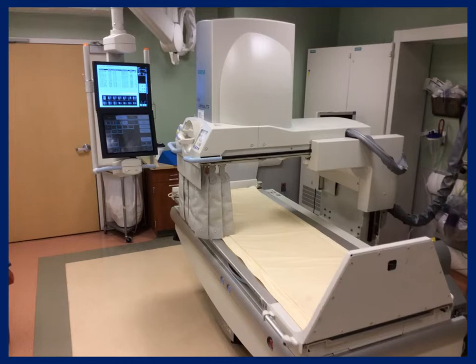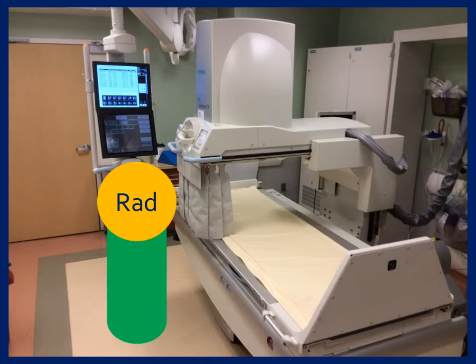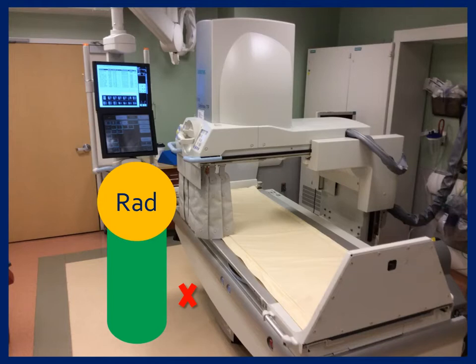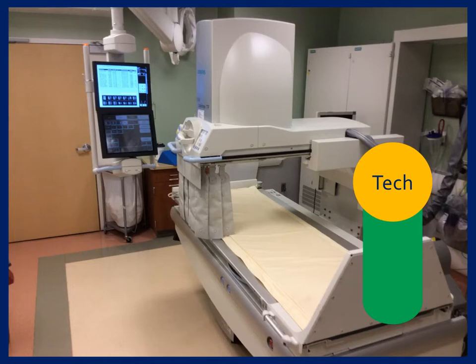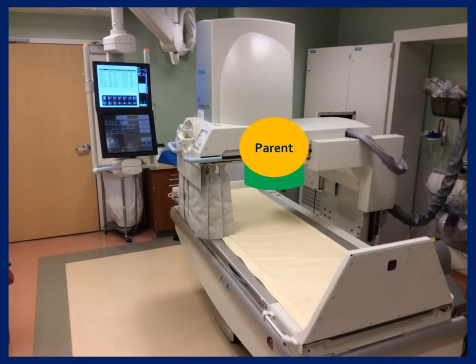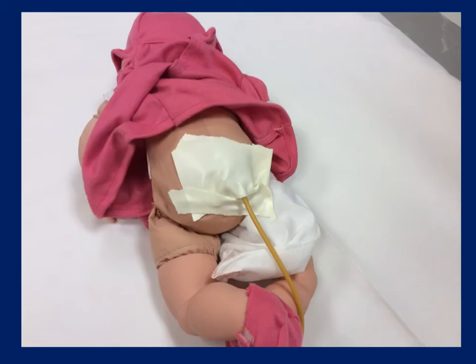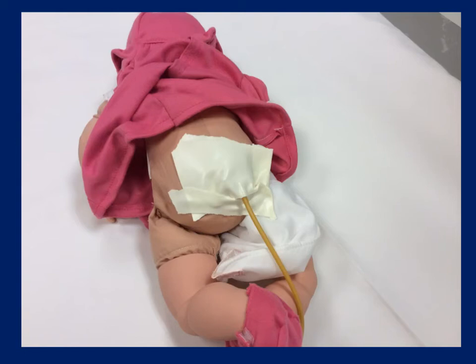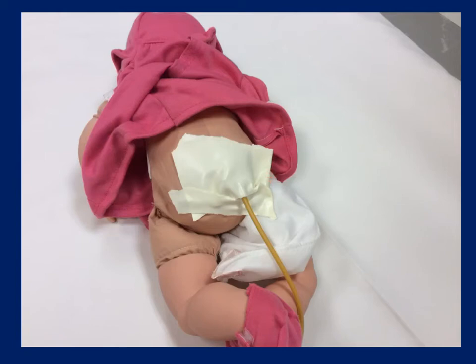For positioning, I like to have the child prone. The radiologist should stand at the foot pedal to have two free hands. The technologist should be positioned to wear a lead glove and help keep the buttocks squeezed together for the best seal. Parents can be at the head of the bed to offer support and help keep the child still. I like to use stretchy foam tape — one piece above, one piece below — with a corner folded to make removal easier.